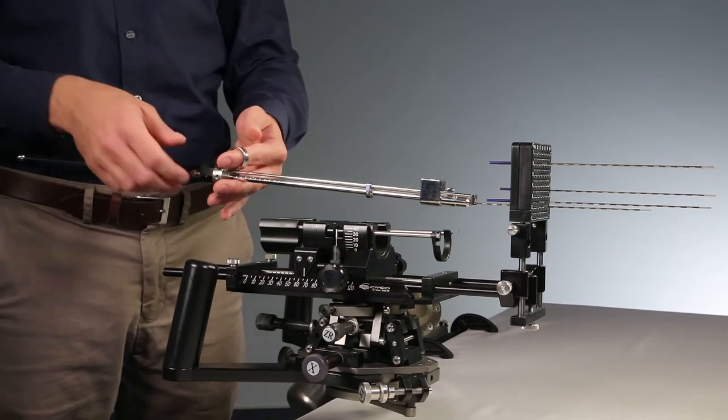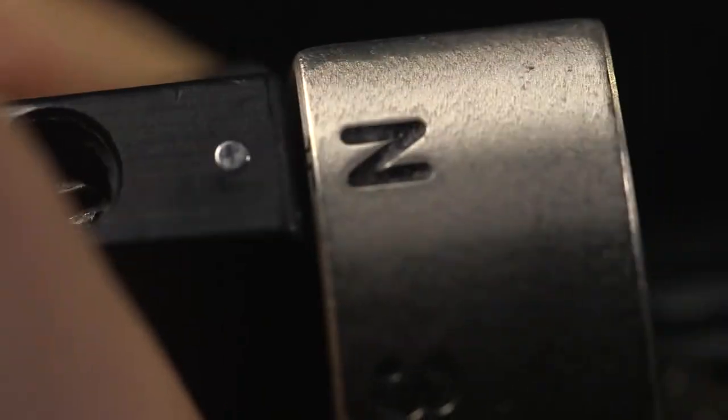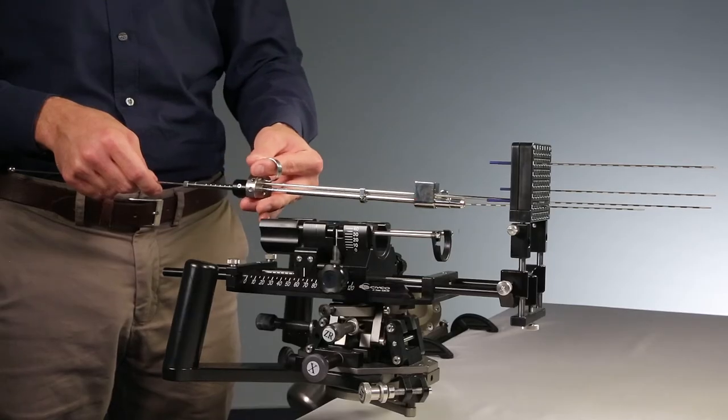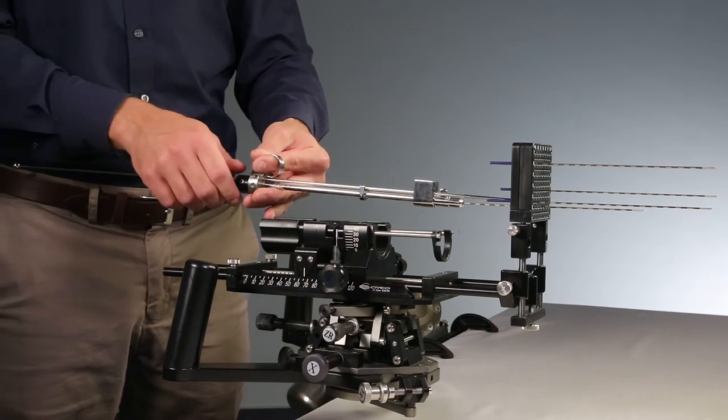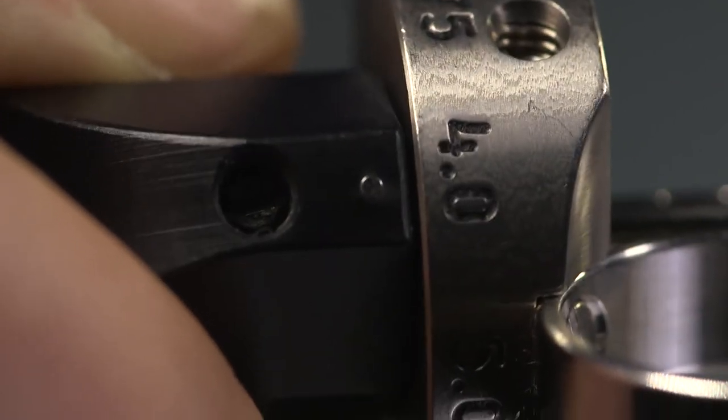Afterwards, set the seed spacing selector to the neutral position N and advance the template wing forward until it flushes against the template grid. Now, you can reset the seed spacing selector to the desired seed spacing pattern.